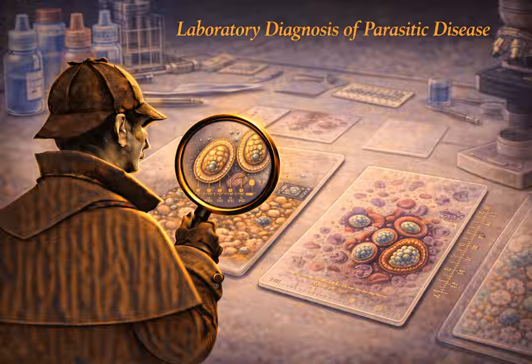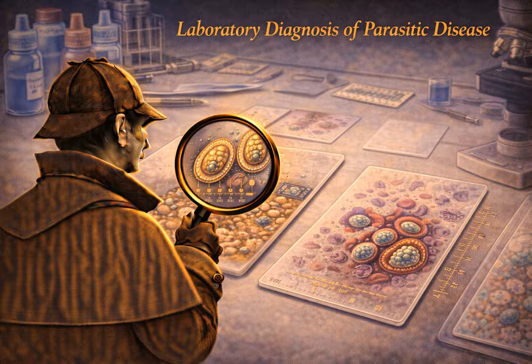All right, let's descend into the most common and frankly the least glamorous part of this job. The stool exam. Section 2. The famous O&P, ova and parasite exam. It is the bread and butter of the parasitology lab. Stool is the primary specimen for all intestinal parasites. But Murray lays down a very strict evidence-based protocol here, which is universally known as the rule of 3.